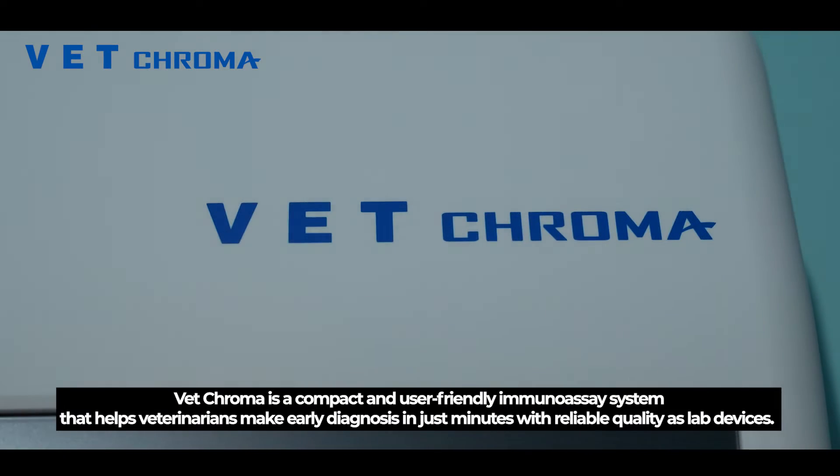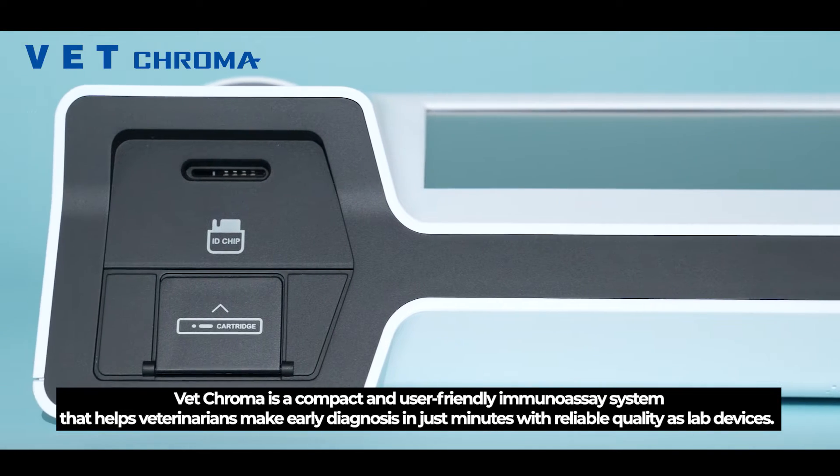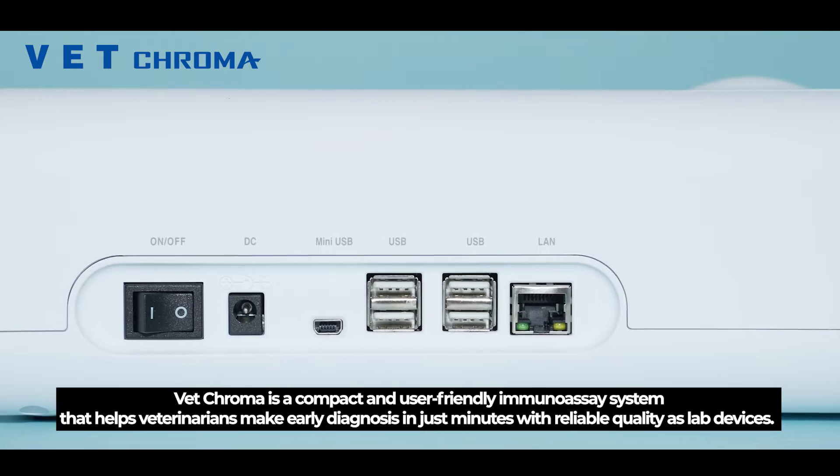VetChroma is a compact and user-friendly immunoassay system that helps veterinarians make early diagnoses in just minutes, with reliable quality as lab devices.